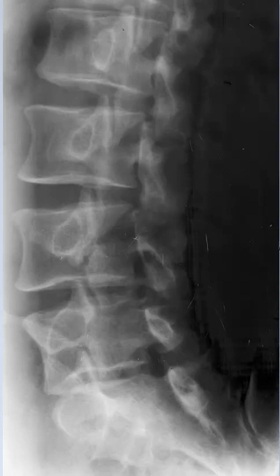Welcome back. This is Dr. Jamie P. Motley and we're going to be doing a lumbar spine oblique projection tutorial today. The purpose of taking lumbar spine obliques is to see the pars inter articularis and the facet joints very well. These views are taken in conjunction with the standard radiographic projections of lumbar spine, which include an AP/AP lumbopelvic and a lateral lumbar projection.